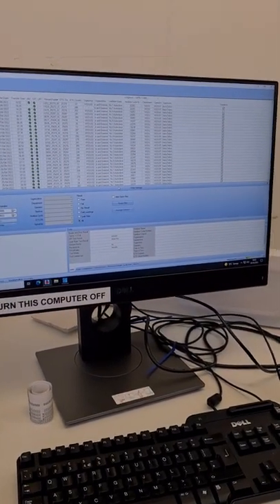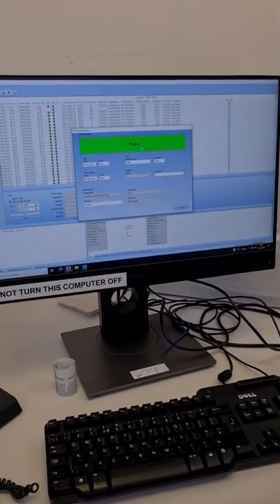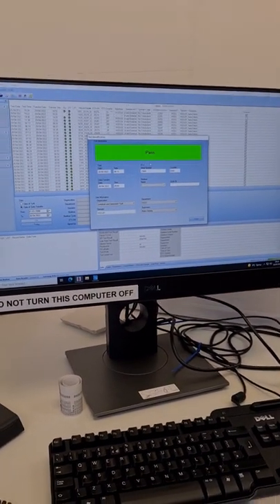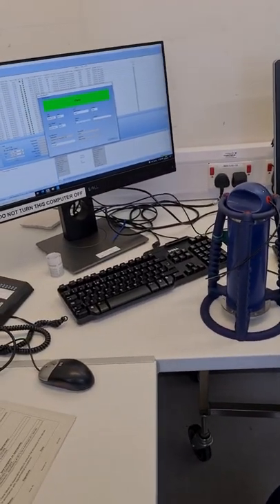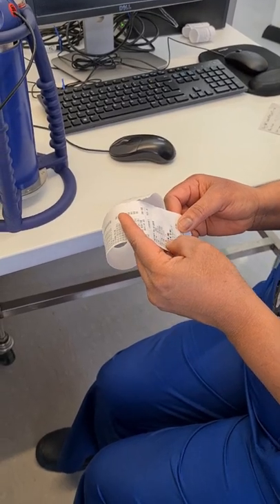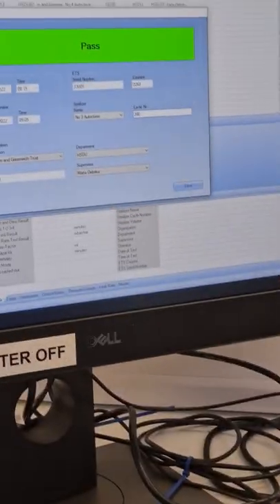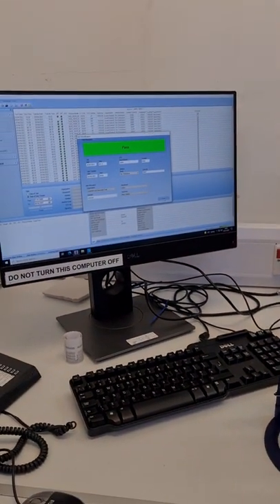The ETS is now downloading into the system. You can see the green light showing that it's downloading successfully. This green light also shows that the ETS test has passed, which means our autoclave is ready for use. I'm downloading autoclave 3, and the cycle number is 20061. I'll proceed to save it.